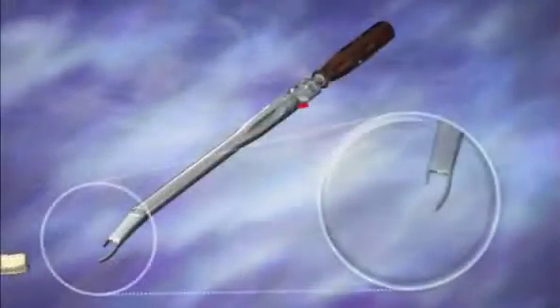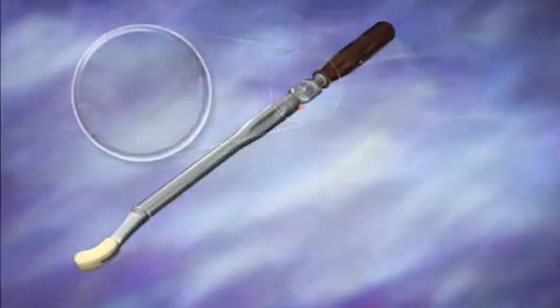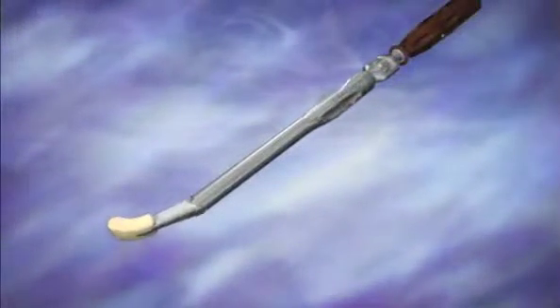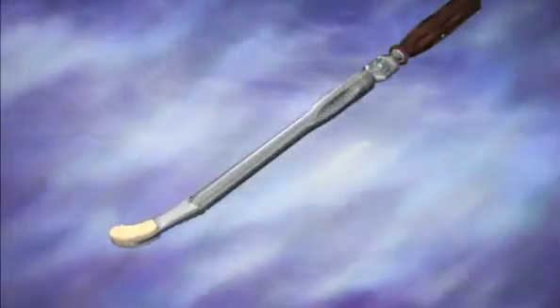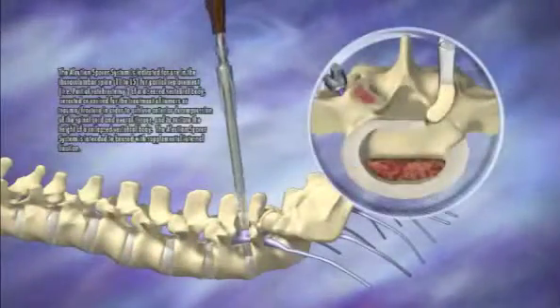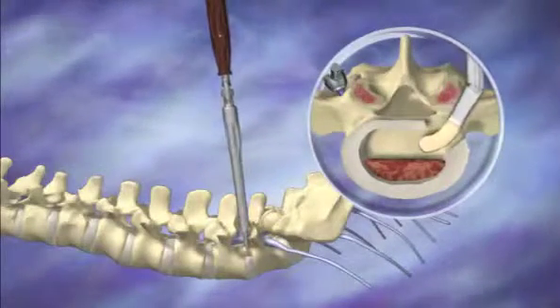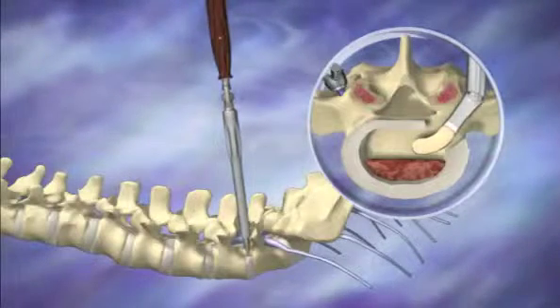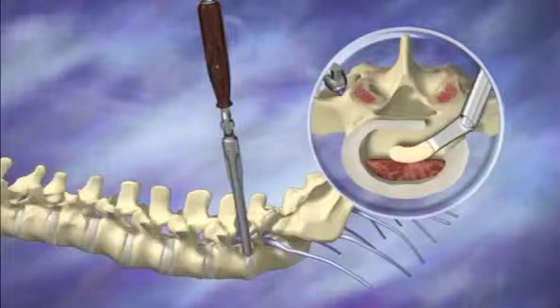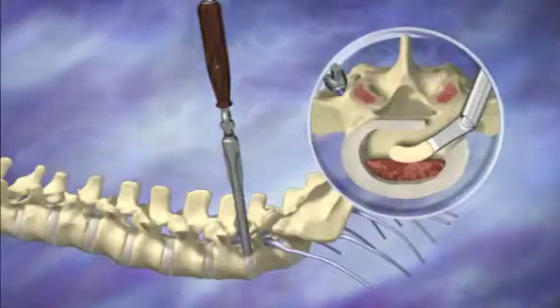The implant is loaded onto the adjustable inserter by turning the thumb wheel in a clockwise direction. Rotating the metallic shaft of the adjustable inserter changes the angulation from -10 degrees to 35 degrees. For initial linear introduction, the implant is introduced at a -10 degree angle. The angle is sequentially adjusted until the desired angle is achieved to appropriately position the implant in the space. Additional bone graft may be placed in the posterior disc space if desired.